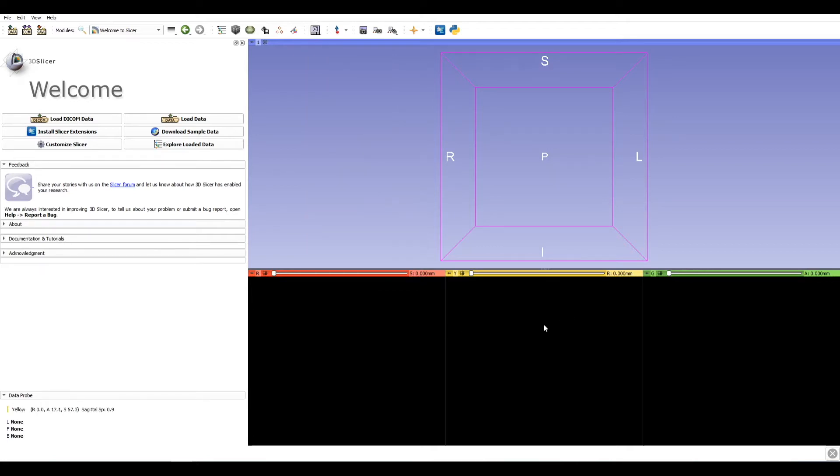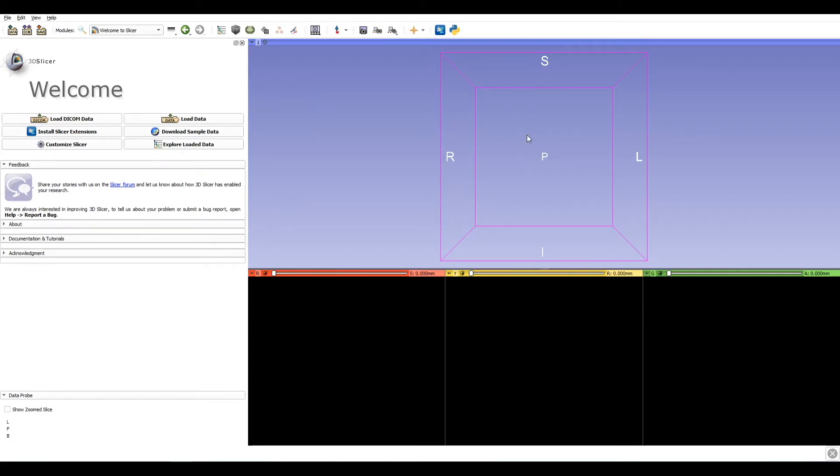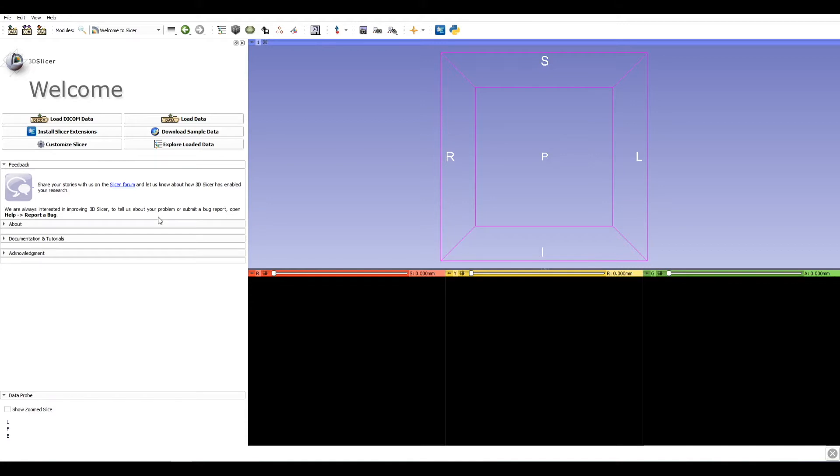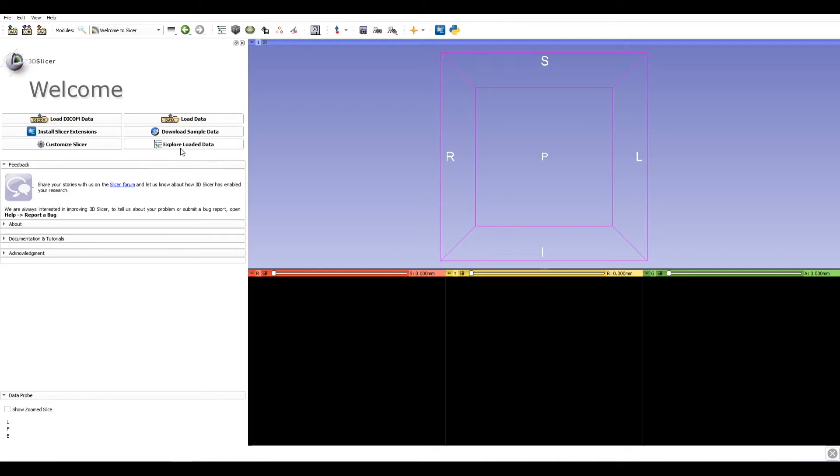Here we have the three orthogonal views: axial, sagittal, and coronal view, and the 3D view. On the left, we find the module panel with all the commands of each module. The first module that we find already open is the Welcome to Slicer module, where we can load data, download samples, install extensions, customize the user interface, and explore data.